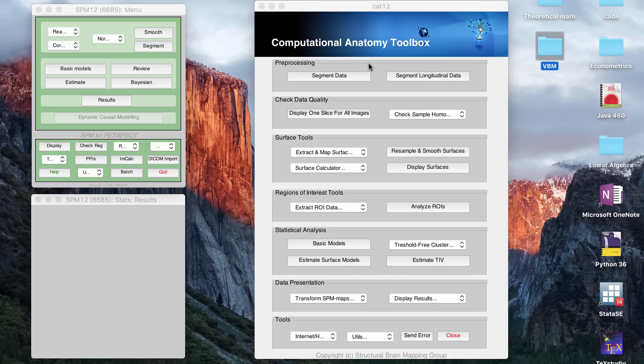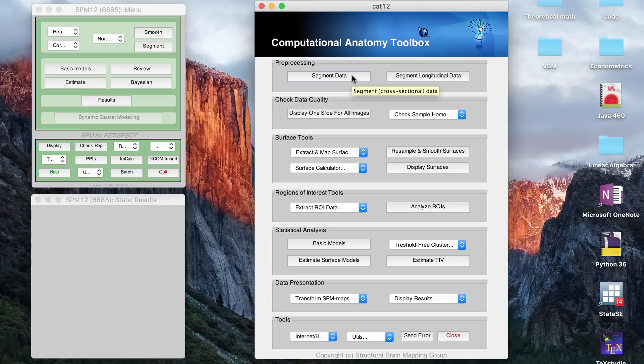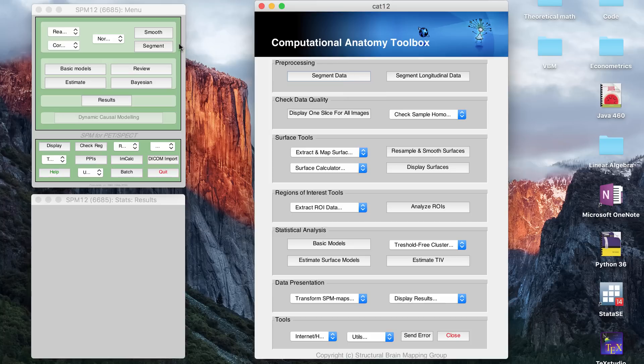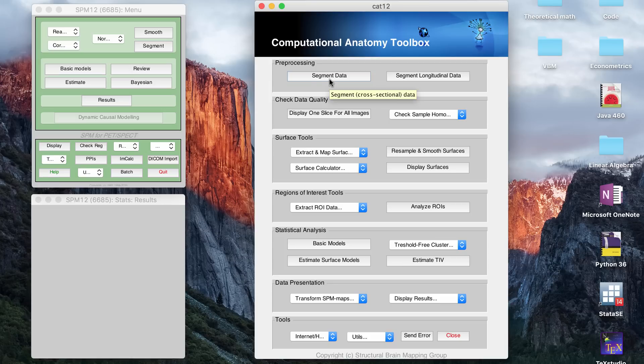And also, so I wasn't saying this because I wasn't running it, but the segment data, that takes about 10 minutes per file. So that is the longest thing from this tutorial. Everything else should run really quickly. So the smoothing, it should be done pretty much instantly, and all the other steps are done pretty much instantly. The segmentation is the only thing that takes a little while.